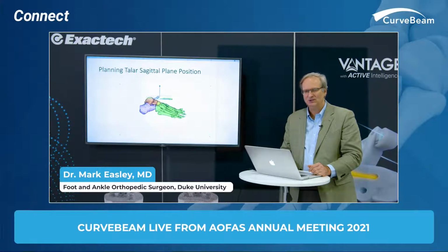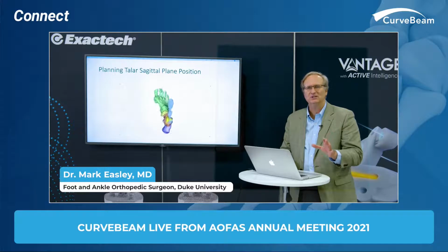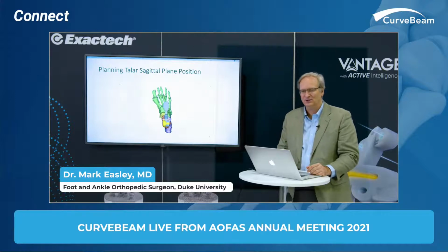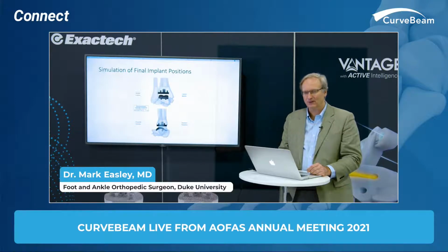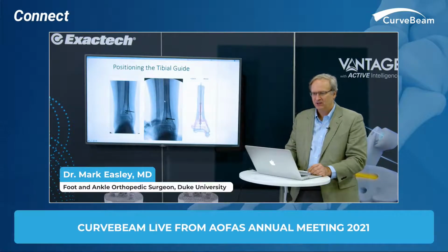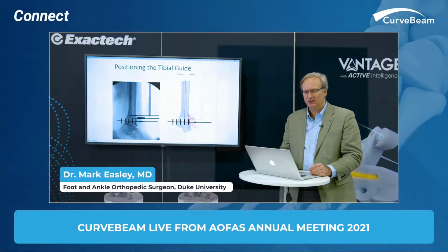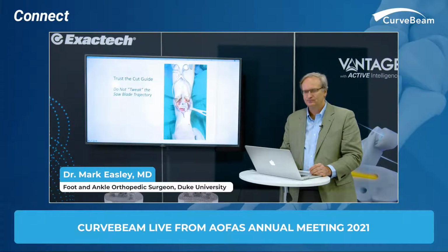So look at it here. See, I'm just going to do these little adjustments. All this is done prior to the surgery. So I put exactly, get the best coverage. I don't have to do any more thinking when I get to the surgery, except for just a little confirming. So then I get an exact idea of what this is going to look like. And here I am positioning the tibial guide, sitting exactly according to plan, talar guide, but again with that osteophyte.